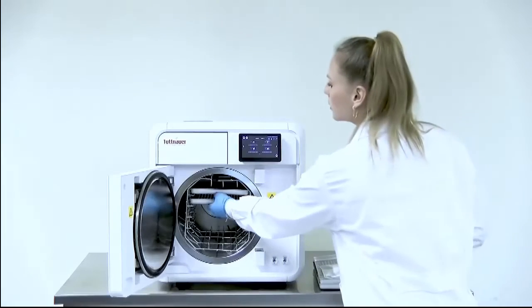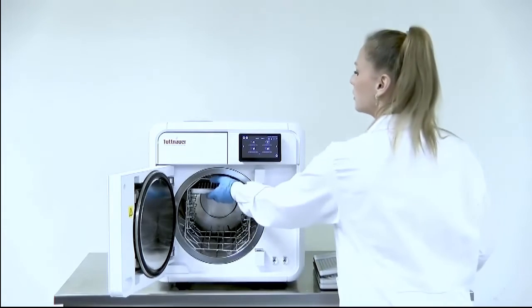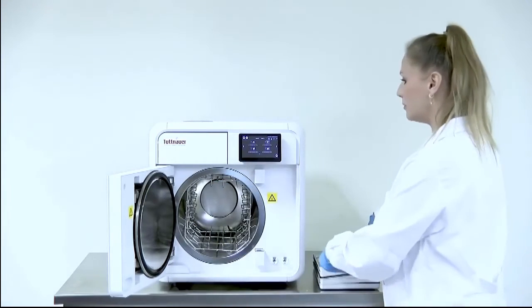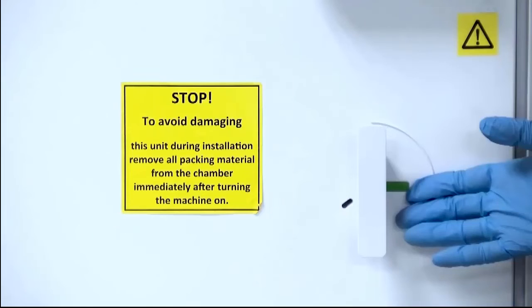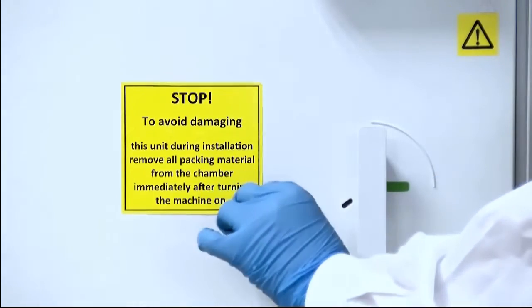When opening the door for the first time, make sure to remove all packing materials from the chamber. Remove the warning sticker from the T-Edge front panel.